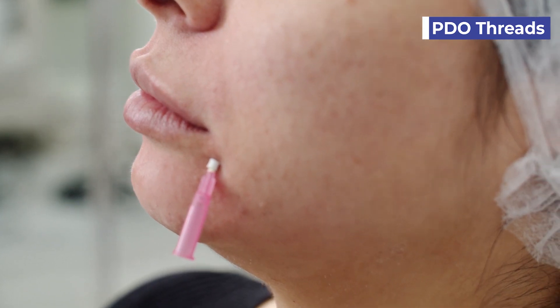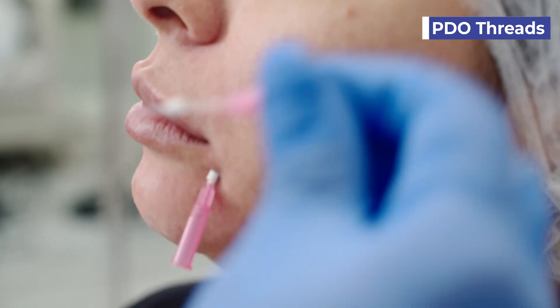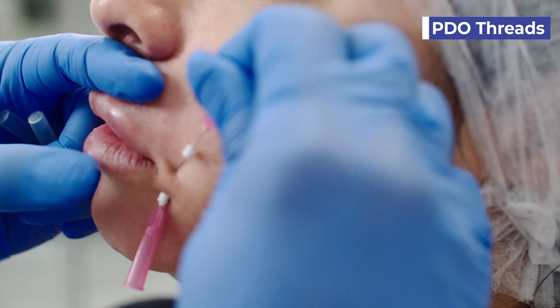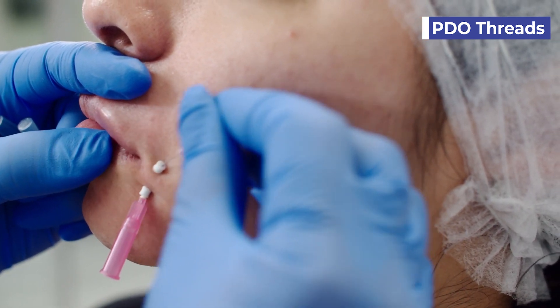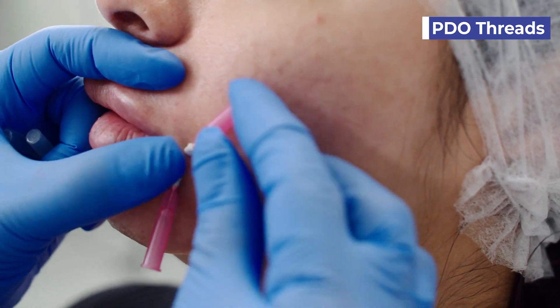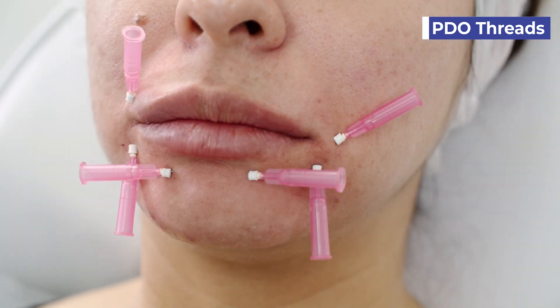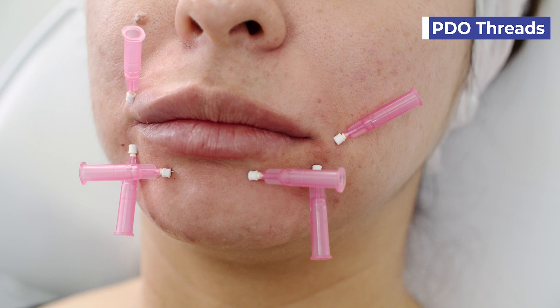I am supporting the oral commissure with PDO threads to help open up the corners of the mouth, and the patient is nice and numb. There are different patterns and techniques whereby we can place our PDO threads.